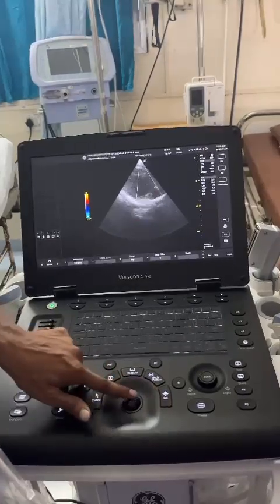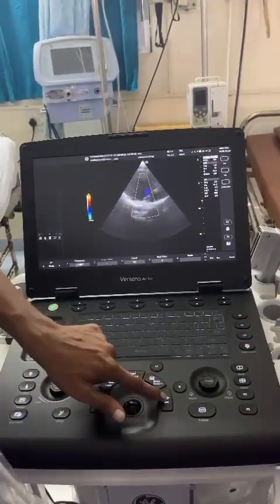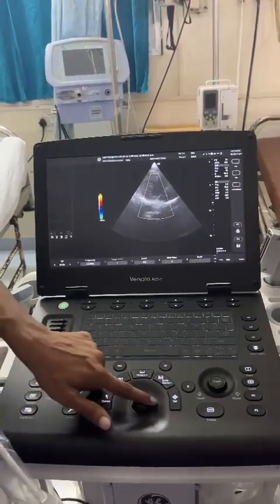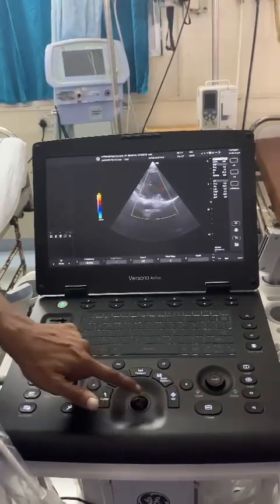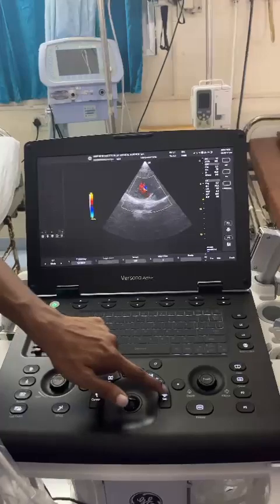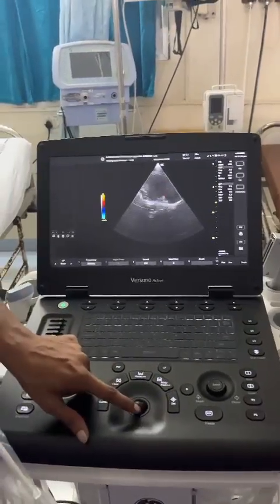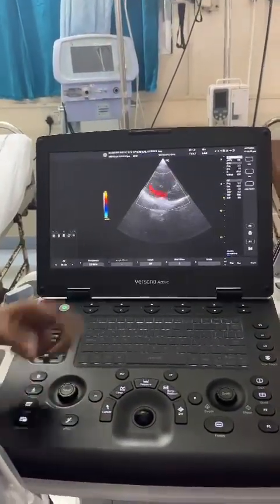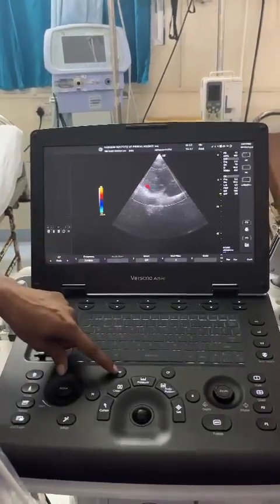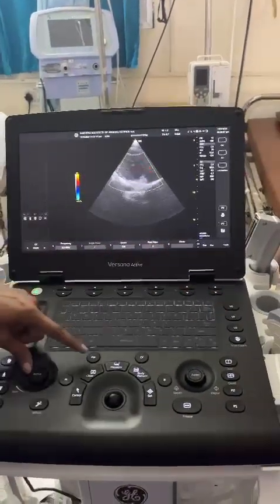You can adjust the position — first change the position, then when you press the set button, you can adjust the size. After adjusting the size, press the select button again to adjust the position. After you get your position, you can go for PW or CW and adjust the size as required.